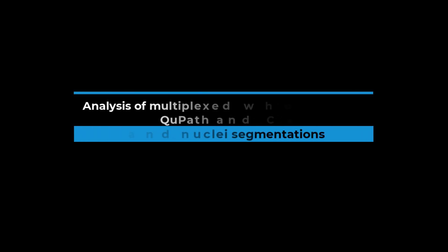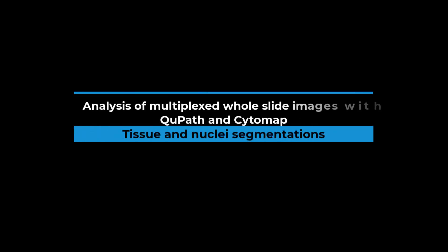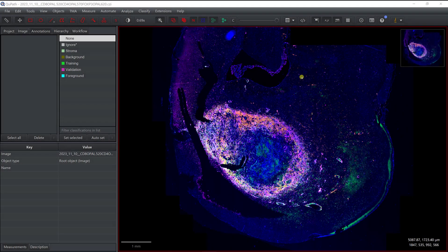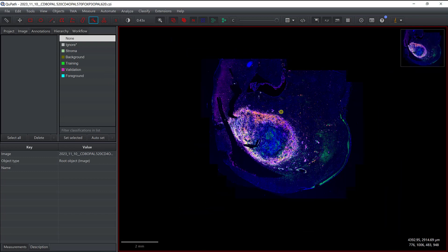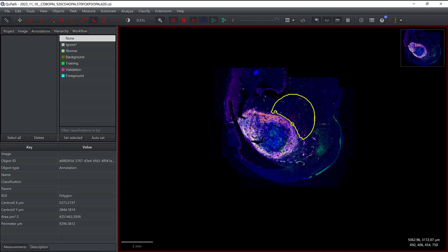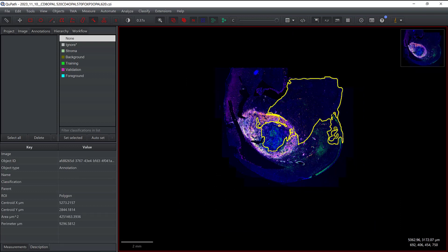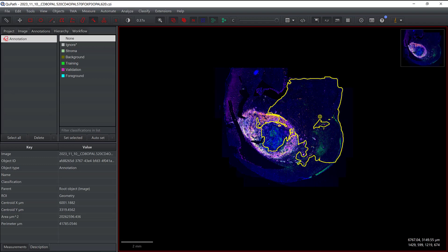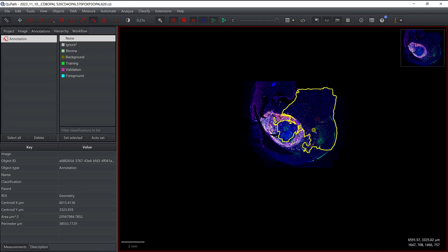In this video I'm going to show you how you can identify the tissue and then how you can segment the nuclei in the tissue. When you want to do that you can use annotation tools, and for example here the magic wand might be a good idea. If you unzoom quite a lot you can actually pretty well identify the tissue.